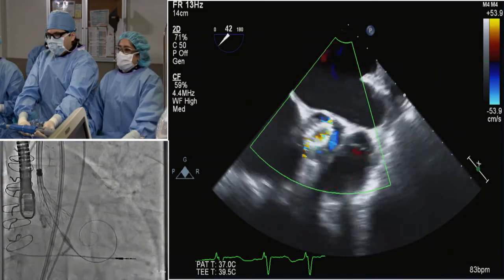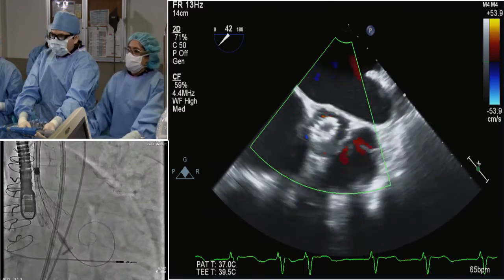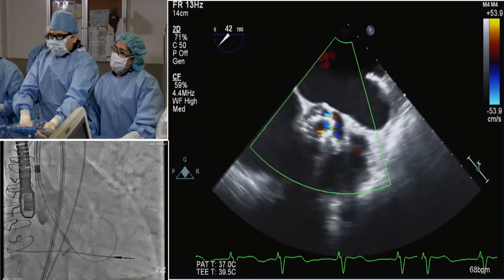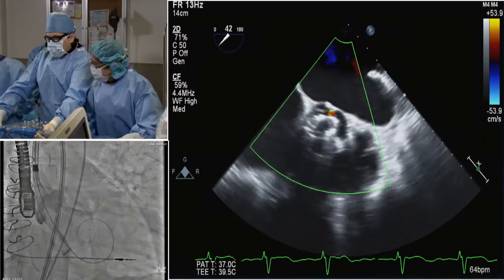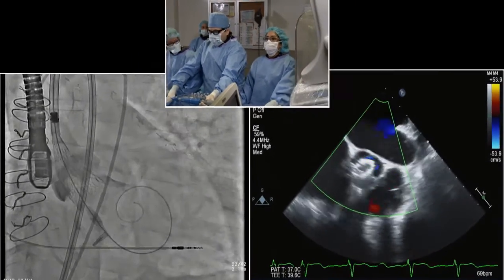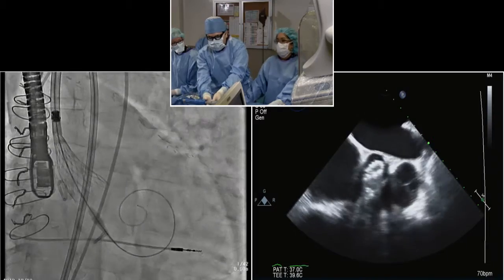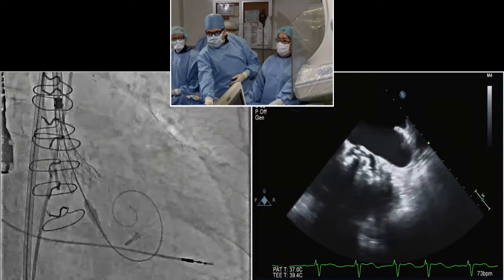Are we able to see the aorta in more than one view to see if it is fully expanded or not? The positioning looks nice there, but it does look a little bit underfilled, underexpanded down the cross-sectional. Yep, correct. Maybe a bit deep, but not too bad.